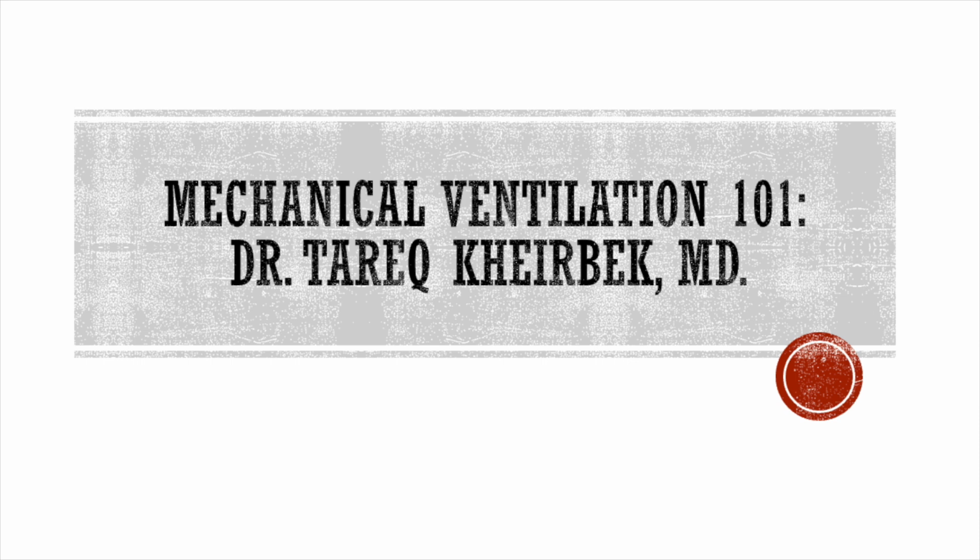Number three, remember the importance of minute ventilation and tidal volume. You want to match the minute ventilation that the patient is asking for. You want to also keep the tidal volume in a safe range, 6 to 8 mLs a kilogram of ideal body weight, not the actual weight, the ideal body weight, which is dependent on the patient's gender and height.